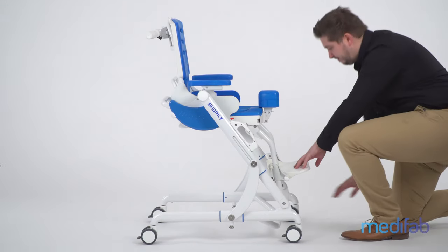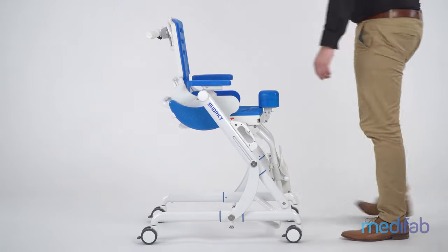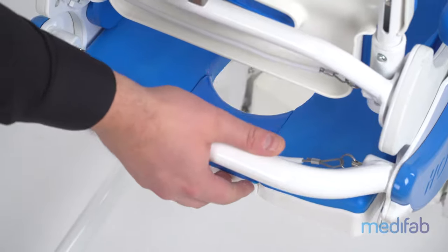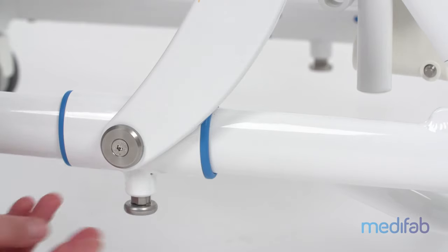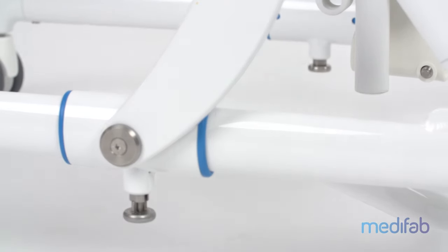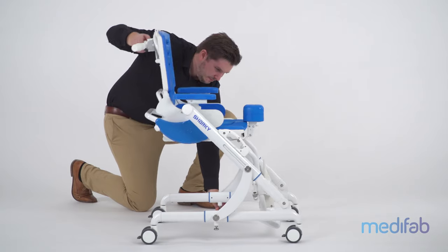Sharky is also foldable with the seat unit attached, so it is easy to store. To do so, first fold up the foot plate and tilt the seat forward into an anterior slope angle. Place the right lower pin in the unlocked position. When the left pin is pulled, the folding mechanism is released.